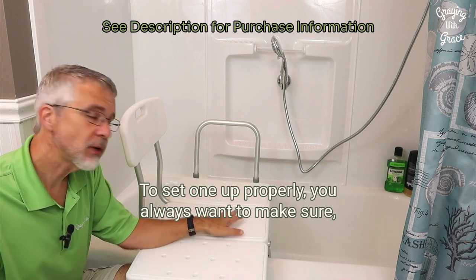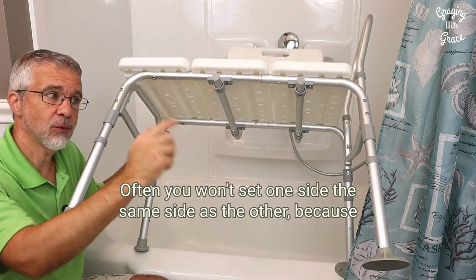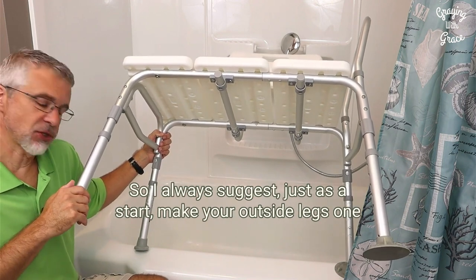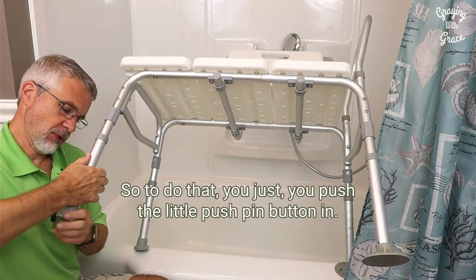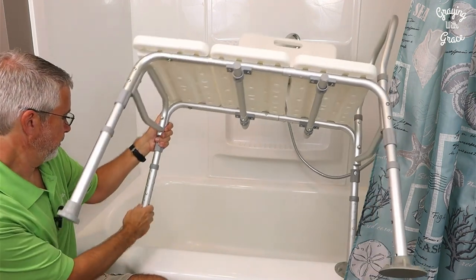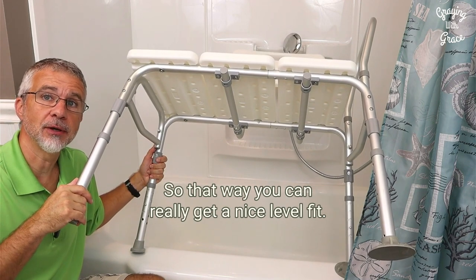To set one up properly you always want to make sure first of all that it's level. To do that, make sure you choose a transfer bench that has adjustable height legs. Often you won't set one side the same as the other because usually your tub bottom is a little higher than the outside floor. So I always suggest, as a start, make your outside legs one click lower than the other side. To do that you just push a little pushpin button in and pull it down a notch.